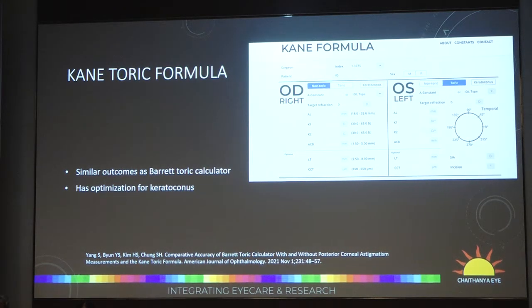However, I would strongly encourage you to think twice before implanting a toric IOL in keratoconus. Only if it is a central cone, a reasonably regular astigmatism, and your manifest astigmatism and the keratometry are matching, only then go for the toric IOL in keratoconus. And don't go for toric IOLs in keratoconus if you think the patient will continue to wear RGP or scleral contact lenses after the surgery.